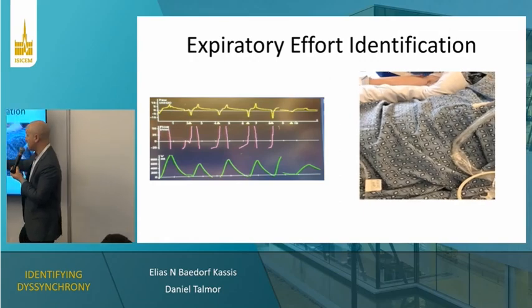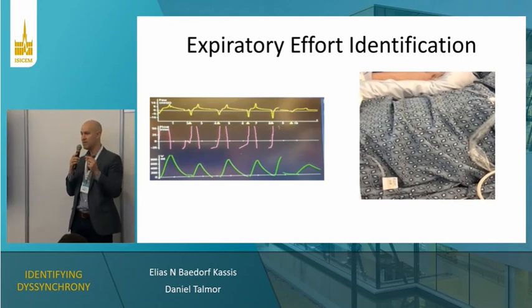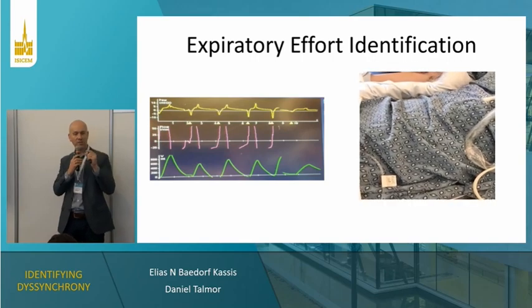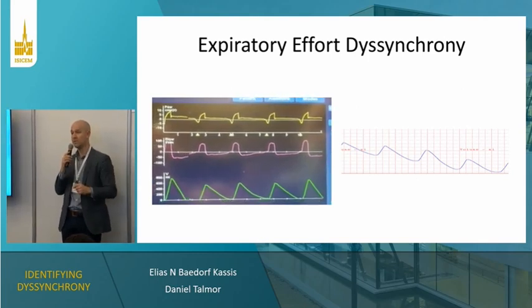The other way is, let's say I have a patient who's on pressure control or pressure support of 5/10, right? And my peak pressure is 25. That is a significantly higher peak pressure than what is being set on the ventilator, and that's an important differentiation from flow asynchrony, where you'll actually see that the pressures are lower than what's expected.